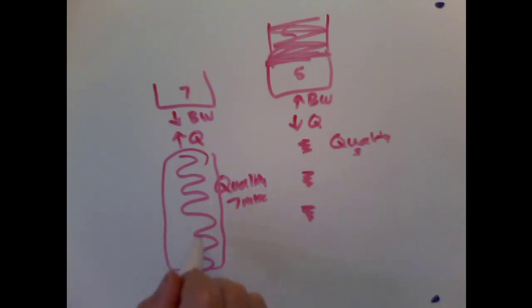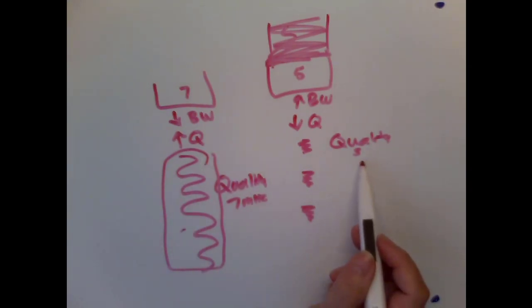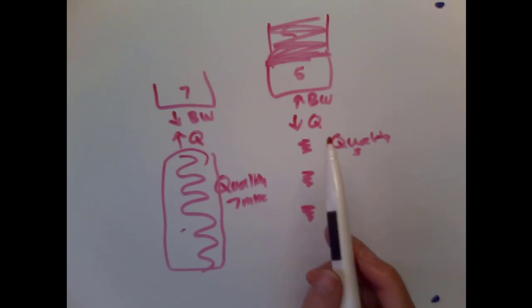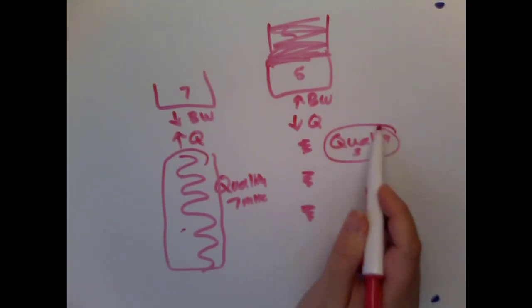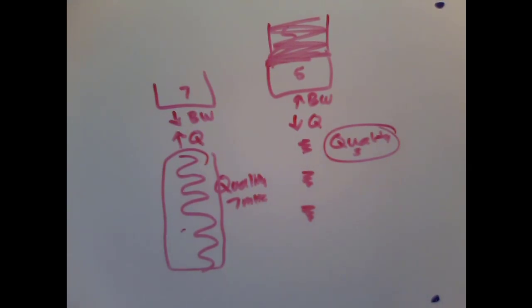So high quality factor means a very pure frequency, and it's mostly associated with continuous waves which do not create pictures. Low quality factors are associated with transducers that have backing material that create short pulses. We know those short pulses create multiple frequencies, so low quality factors actually improve our images.